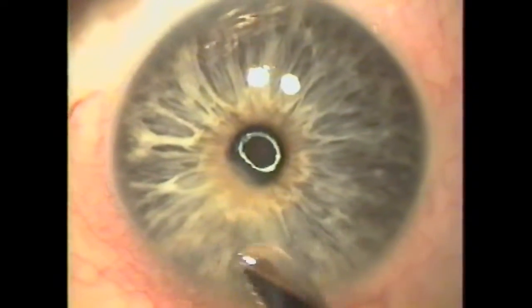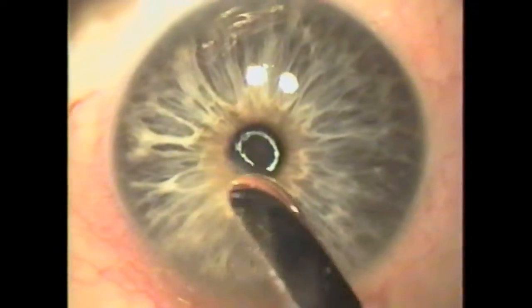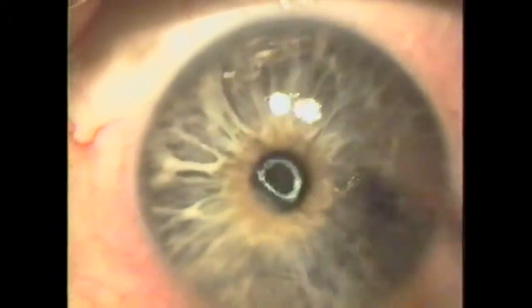This is the case of a dense corneal scar following a herpetic infection 20 years ago. Notice the circular light reflex here is D-shaped due to higher astigmatism.